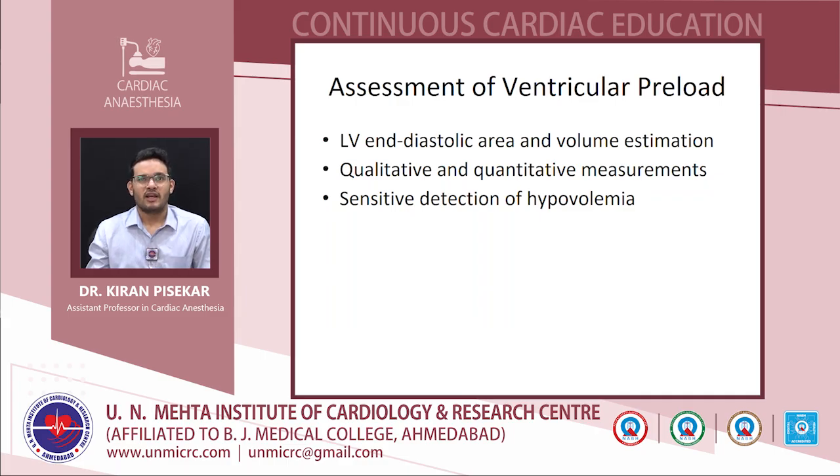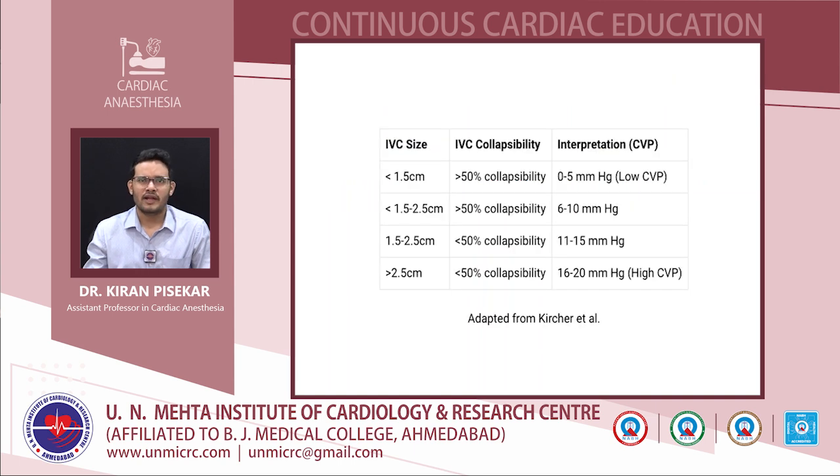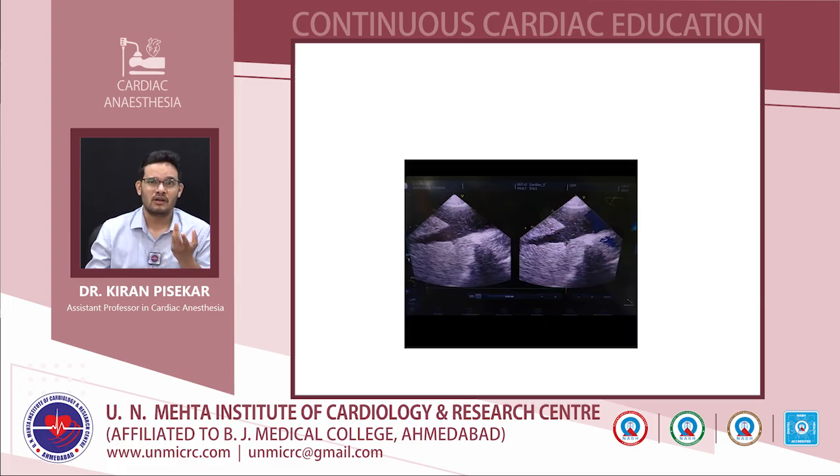Now, it also helps in assessing the ventricular preload. LV end-diastolic area and volume assessment, and qualitative and quantitative measures can be done to assess the preload of both the right and left ventricle. There is a slide showing the IVC size and IVC collapsibility, which helps in interpretation of the CVP.